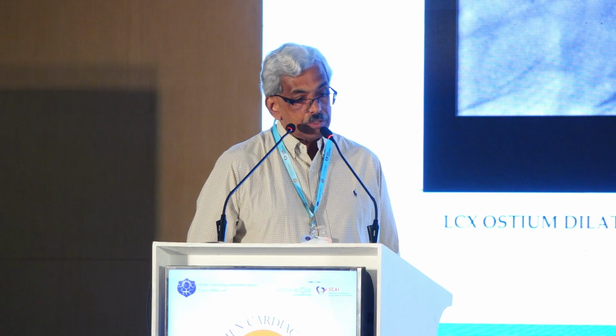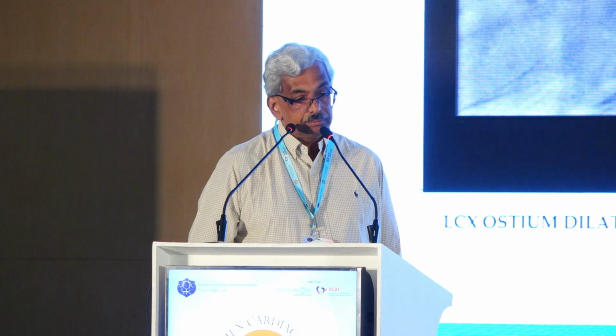You do the POT, you finish the POT, you circ rewire, you do circ dilatation again, you do the LAD dilatation, the second kiss, and then you finally finish with the last POT. So this is a sequence of DK crush which you should do stepwise in every patient who has a DK crush. Now the question is, we did all this.